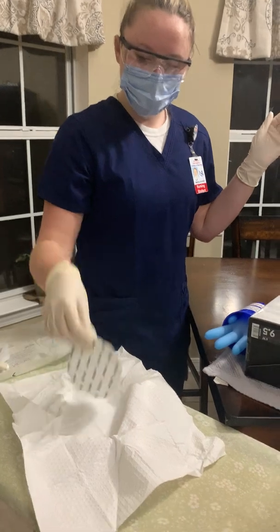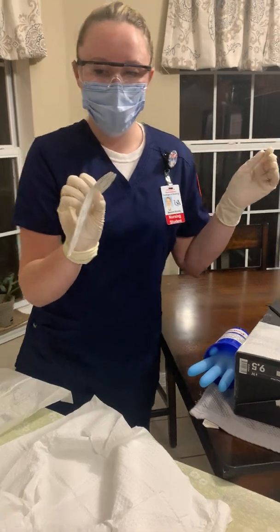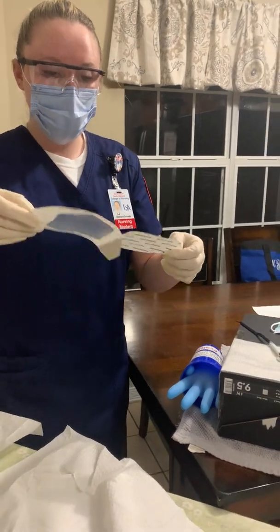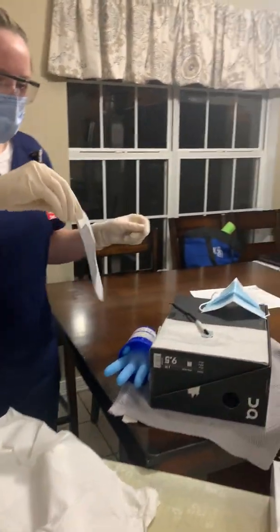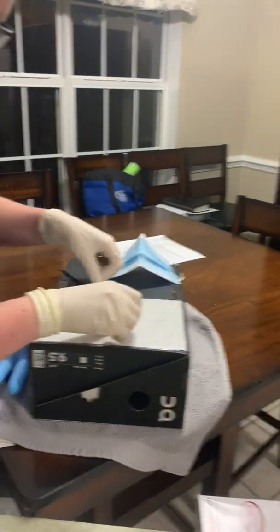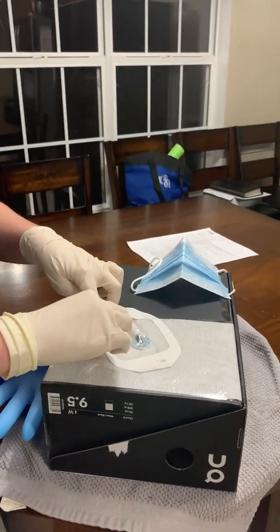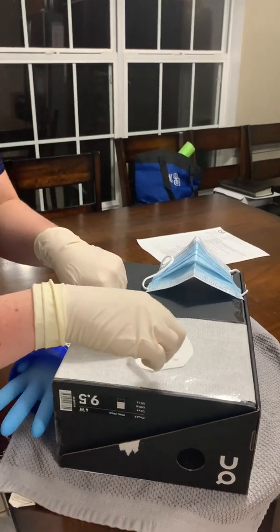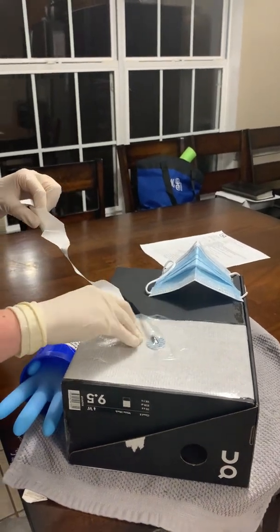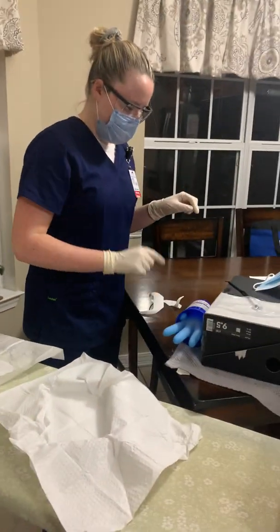So I'm going to go into my sterile field with my sterile hand and grab my container. Now I'm going to take this off with the non-sterile part with the wrapper on my non-sterile hand and throw that away. And now I can place the dressing on this site. Okay, now I did that, I can go ahead and pull. I'm making sure to cover the hub when I put this dressing on, that way I will not touch it. There we go. Okay, and I'm going to keep this to the side right now because I will be using that label in just a moment.